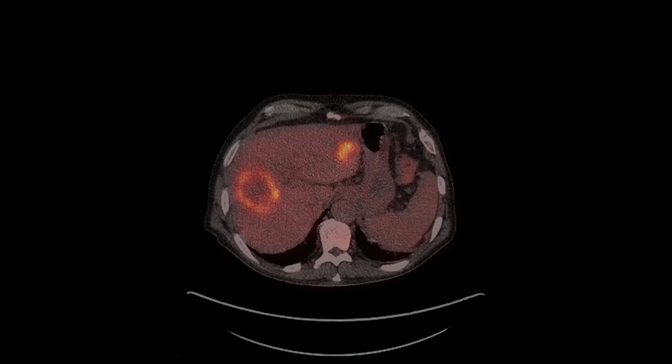You'll remember before I said the X-ray scan is like the photograph of the country during the day. Well, our PET camera has now made the photograph of the country at night. Our FDG has gone to places that are using the most sugar, and they'll be the brightest on our pictures.